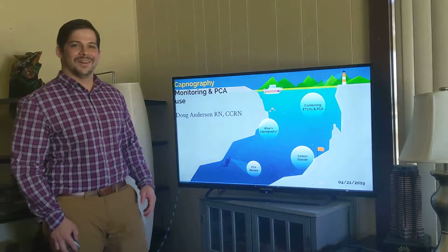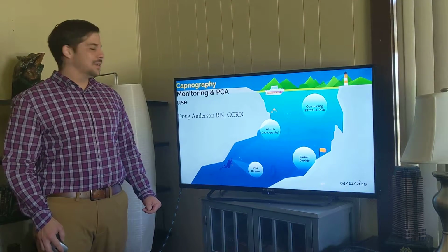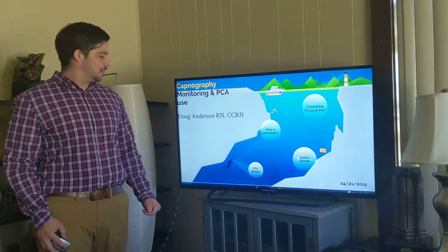Doug Anderson. I'm an RN on the Surgical Intensive Care Unit. Today I'm going to talk about capnography monitoring and PCA, or patient-controlled analgesia use.